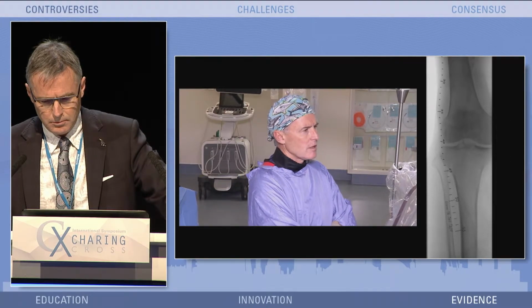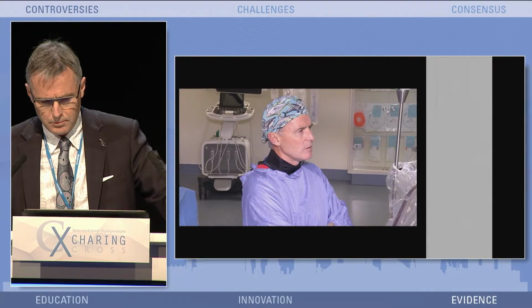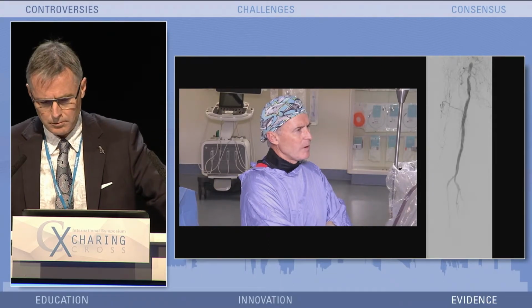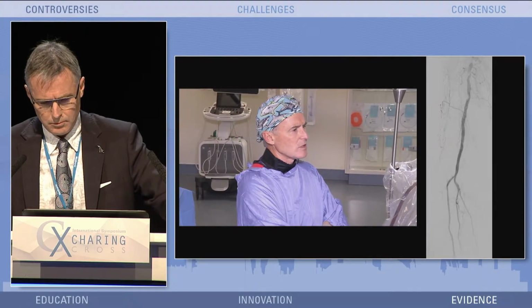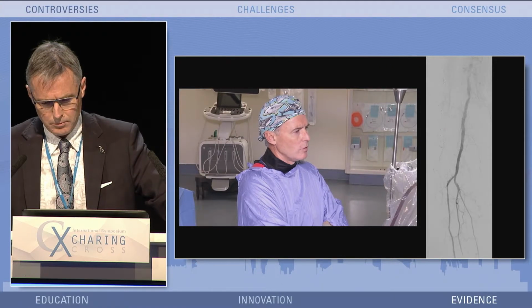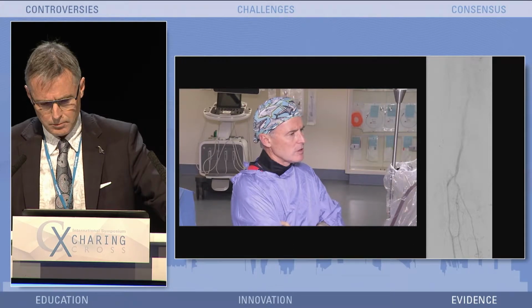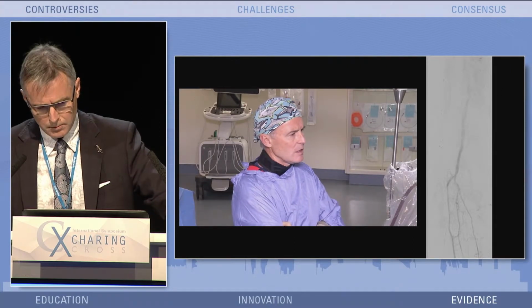So an interesting case. If we go forward with the subtracted images, then you can see that critical stenosis of the distal FCFA above knee popliteal, further P1 stenotic disease, then P2, P3 look good, as is the anterior tibial artery. Peroneal and posterior tibial are patent but diseased.